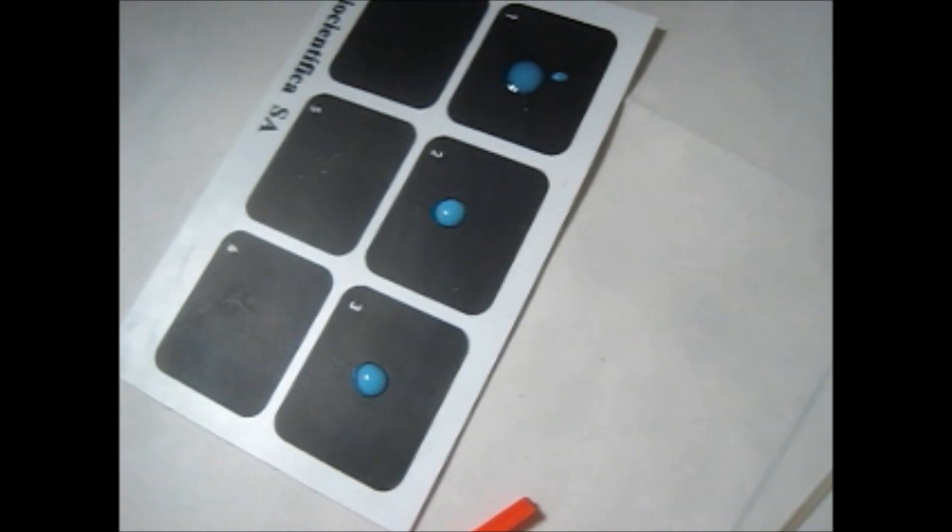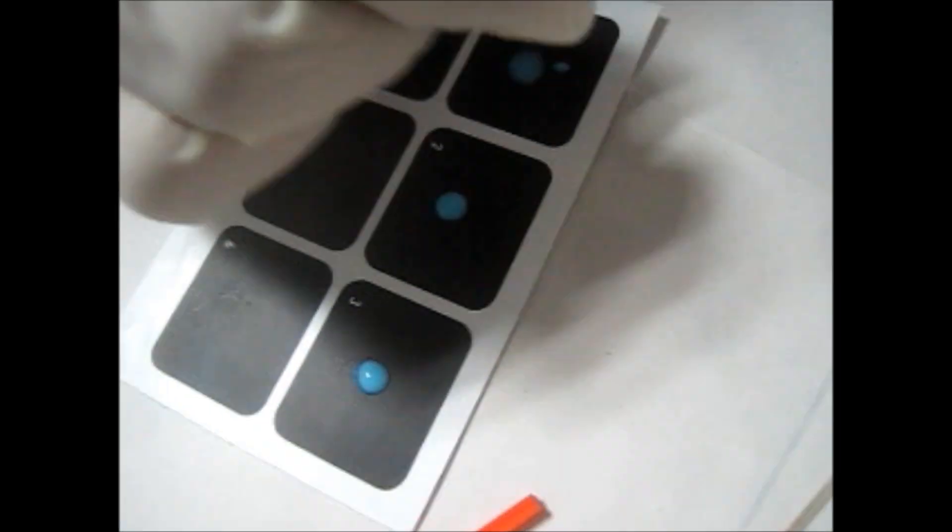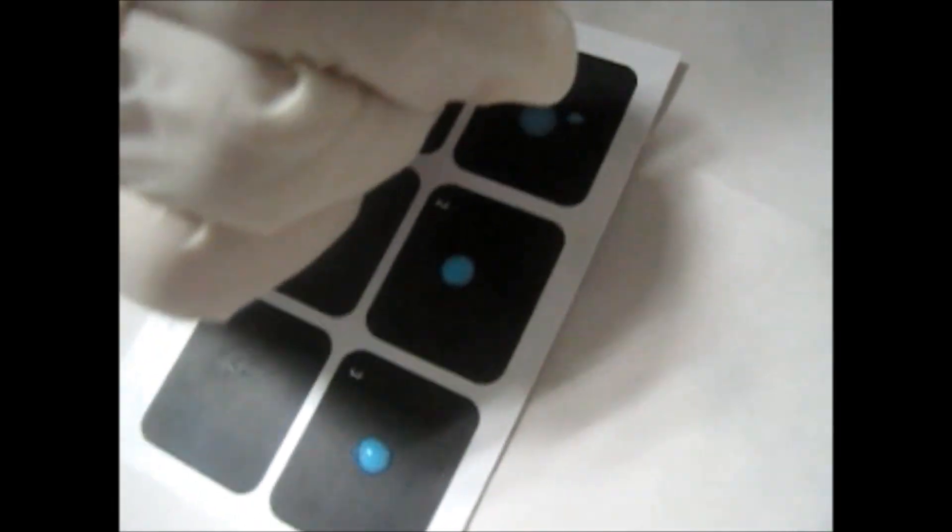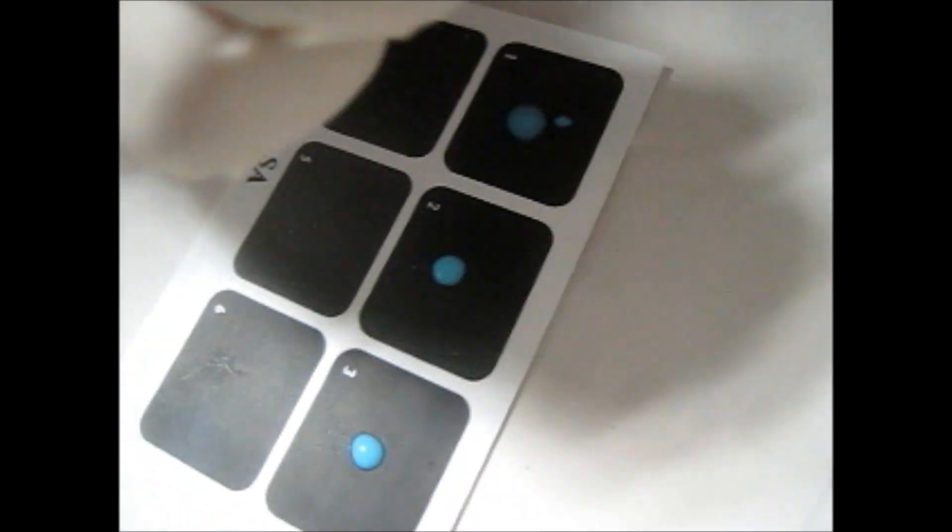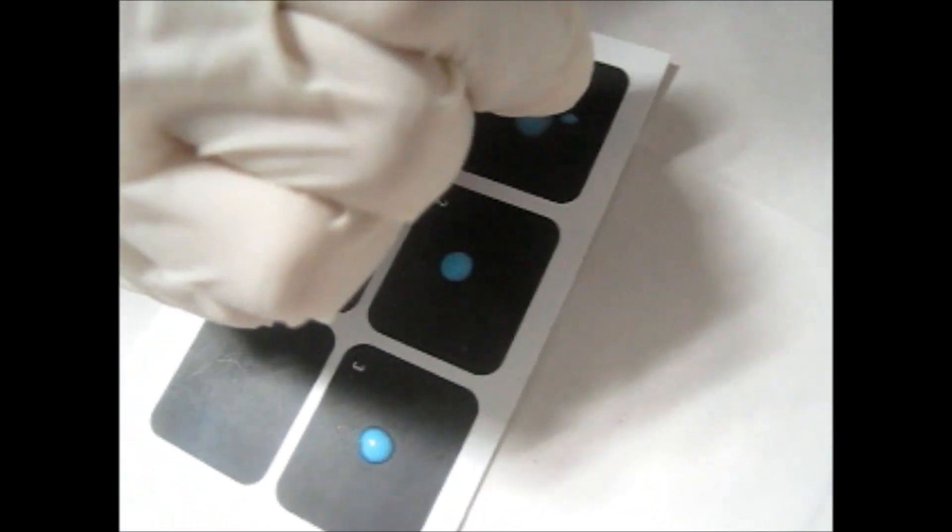Now on number three, put one drop of negative control.